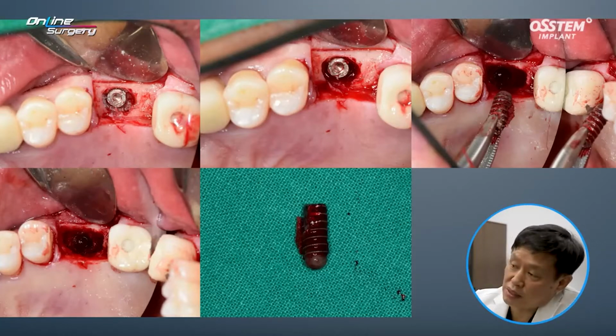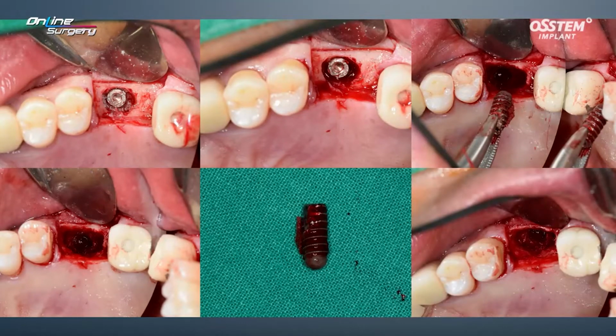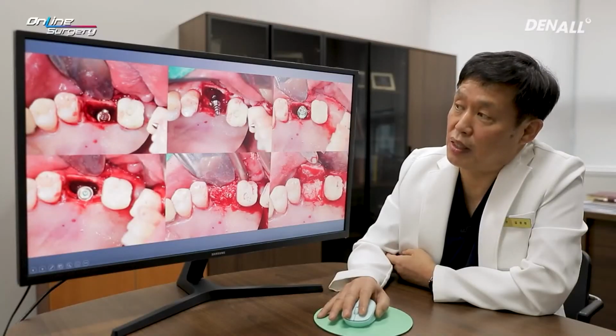This is after implant removal. You can see that there's a hole where the implant used to be. If you look at the palatal side of the patient, you can see that there is still residual bone because of how it was originally placed, and therefore I attempted to place the implant once again. Side cutting burr was used for side cutting. Guide pin was used to check the position. I did 2.2 drilling, however, on the buccal side, it is fully exposed, and it only engages slightly on the palatal side.